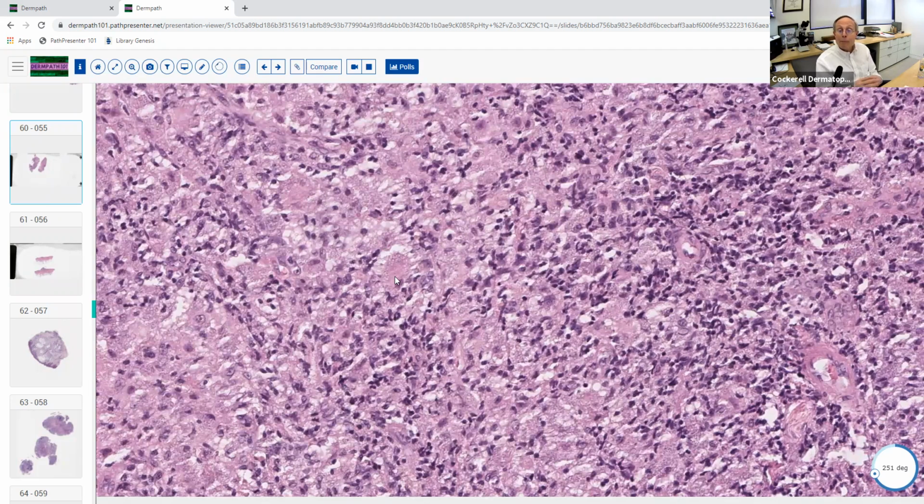Okay, now is it the capsular material of crypto? No, that's a large amount. The ratio between the capsule and the actual organism in crypto is probably about 2 to 3 to 1. There's a lot more capsule than there is organism in crypto, especially in the mucogelatinous form. In this disease, the capsule is just a teensy tiny little capsule that you can barely see with our highest magnification here. And notice that they're present diffusely in this histiocyte. In fact, they're all over the place here, but you can really see it well in this one right here.